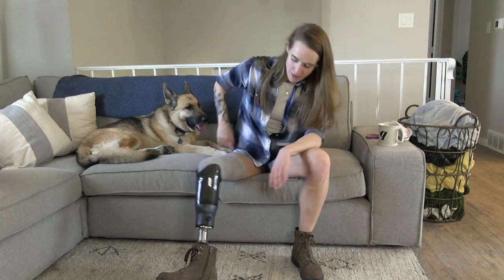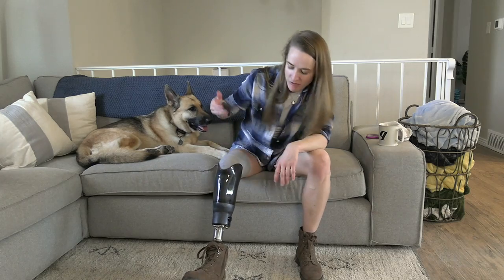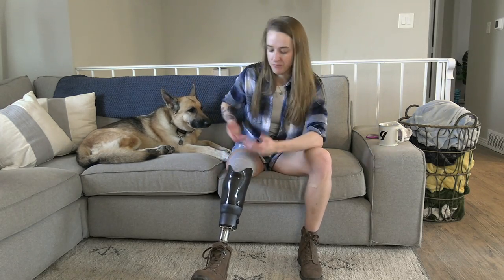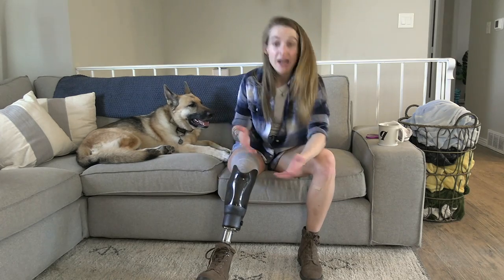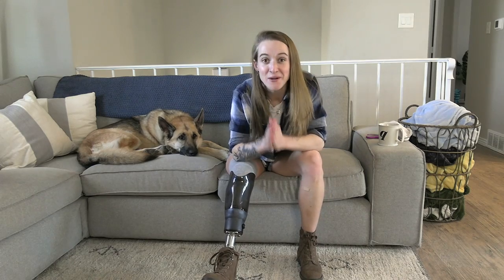Also aesthetically, especially with some kind of sock, which I could change the colors out, matching an outfit or whatever, I like the way that this looks so much better. Without that big sleeve coming up my leg, my skin also has more room to breathe. And if I'm wearing leggings, I can just tuck them into the top there. Super easy.